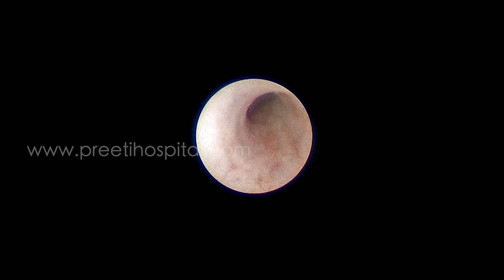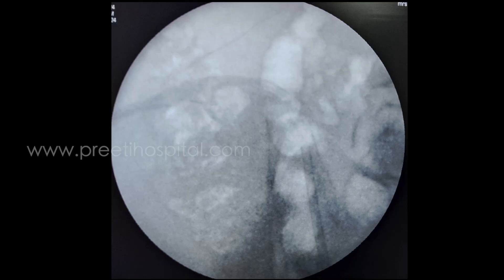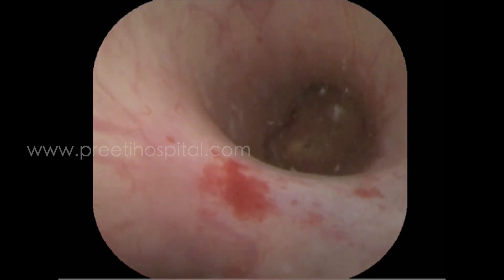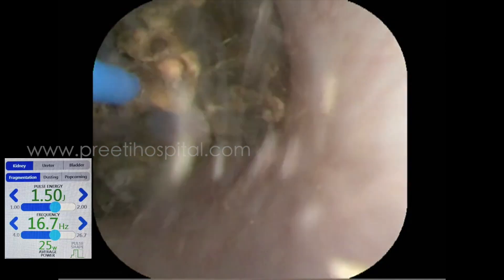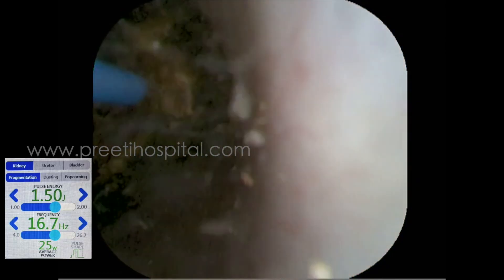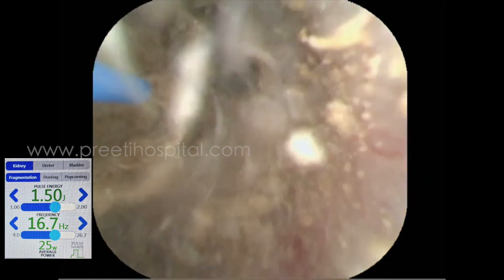I changed to a normal sheath, but the normal sheath also did not go. Then I inserted the access sheath over the visual obturator technique — that is the 4 by 6.5 ureteroscope access sheath. This access sheath is the normal 9.5 by 11.5 Cook access sheath which we use routinely.